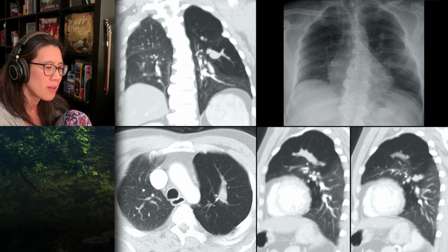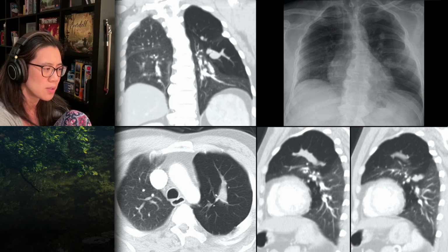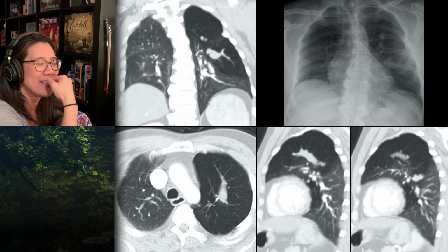I don't know whether the fact that there's vascular pruning helps you decide whether it's an acute or a chronic process. That I'm less certain about. I can tell you it's been unchanged for 4 years. Perfect. Since the first X-rays, we've had follow-up because of the cervical spine issues for 4 years, and the chest X-ray is unchanged. Okay. And no one's done anything about it. Oh, that's not good.